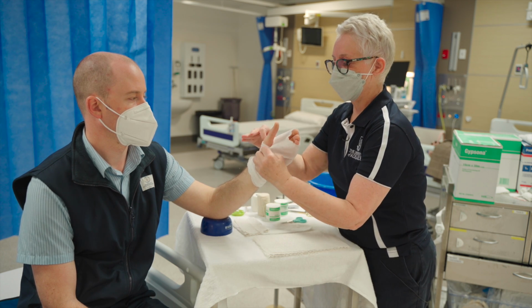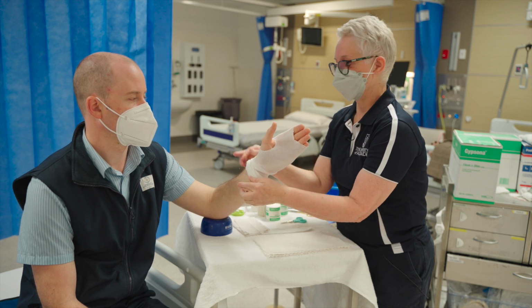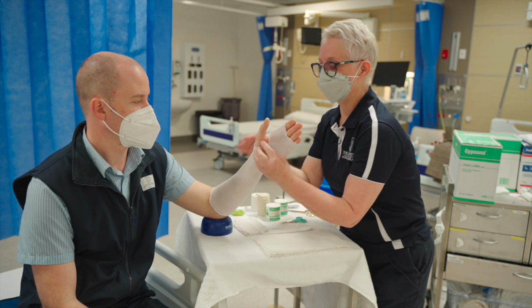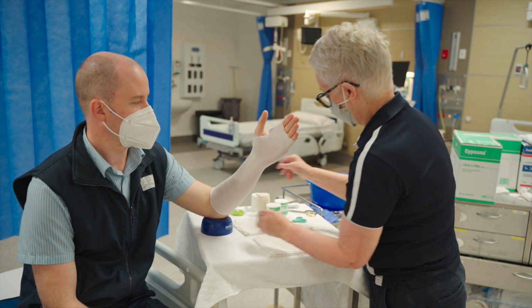The important thing here is making sure that the hole is not too big because your plaster is going to come up around your thumb. So we roll that down gently like so, just making sure that everything is covered and there are no creases.